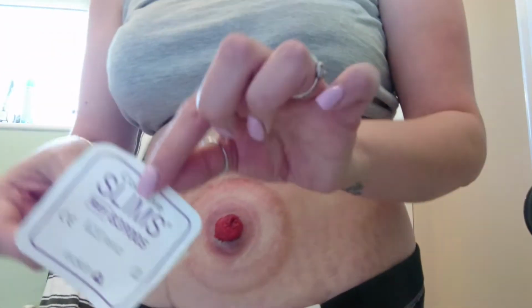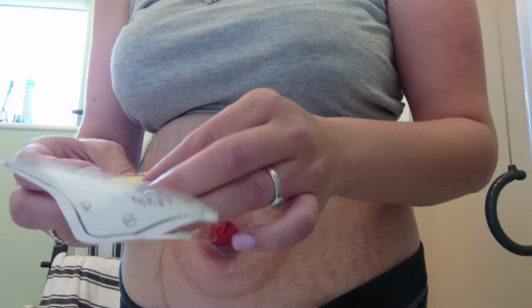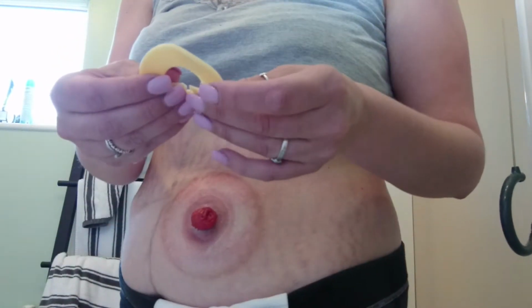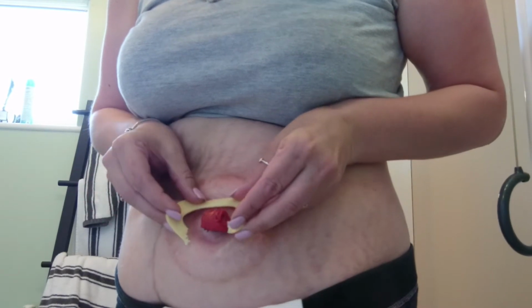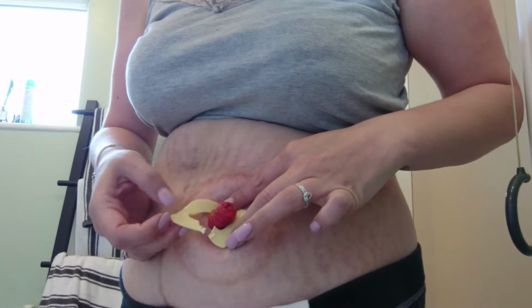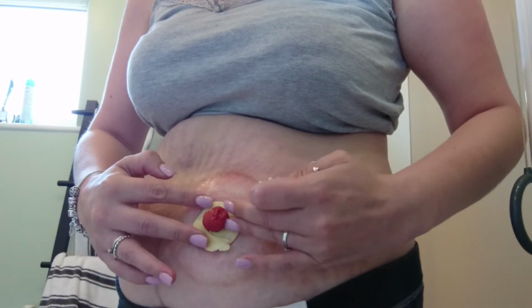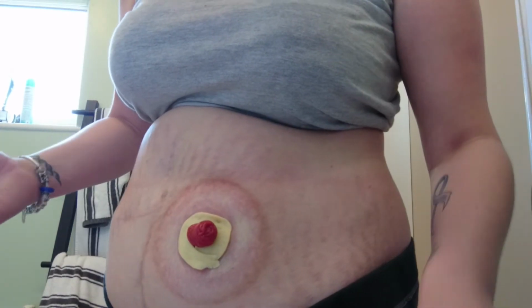Right, so next I'm using the Eakin Slims, which is the barrier ring. As you can see, I've already taken mine out and I've already ripped it, because to me, you always need a master's degree in how to put these on. I've finally got the hang of it, so I literally just spread it a little bit and I put that round as such, and I do that. These do get rather sticky, so I take off the little extra excess, and I push it down. So that is my barrier ring on.